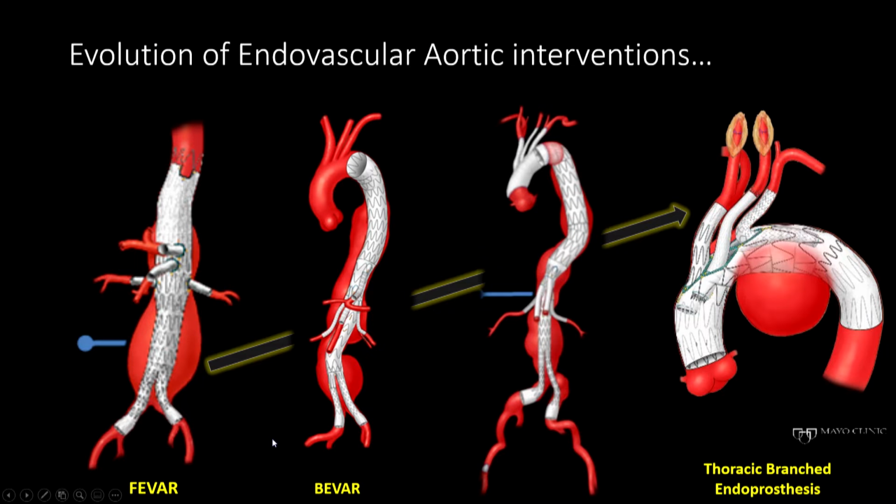And just to set the stage, as you all know, I don't have to preach to the choir here. Aortic disease in general has conventionally been treated with open aortic interventions or surgeries, and now endovascular options are coming along. What started as standard EVAR and fenestrated EVAR to branched EVAR, now we are looking at technologies from device companies for aortic arch and even ascending aorta for type A dissections, for example. So eventually we would be at a point where we could potentially do, in theory, endo-Bentall for these patients, given all the device and imaging questions have been answered. So that's how I want to set the stage.